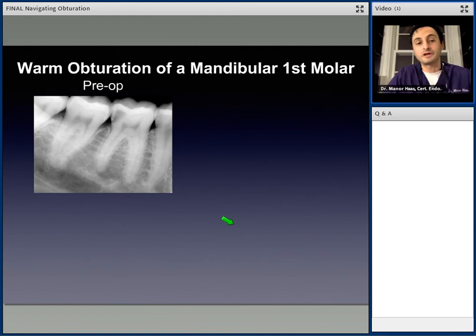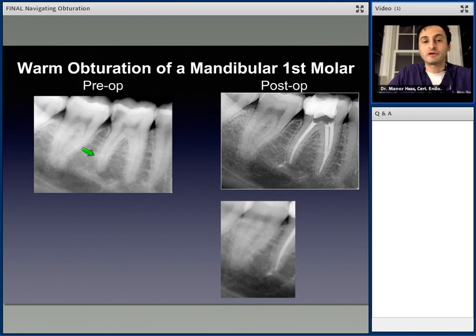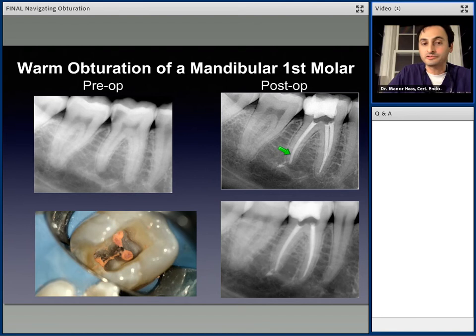I'll show you this lower first molar. There's the before, and there's the after, and let me show you how we got to this. Okay, so no one's going to say when you look at this obturation, well, Manor, you know what? You kind of cut corners, you instrumented it to a tiny size at the apex, it's not filled well. There's a lateral canal, by the way, right there. No, there's got to be a catch. So let me show you this case, and let me show you down here in the lower left image just what we've been able to accomplish. Look at how nicely I've obturated the two mesial canals, the distal, and even an isthmus right there that's between the two mesial canals. So here's the video of this lower molar case.